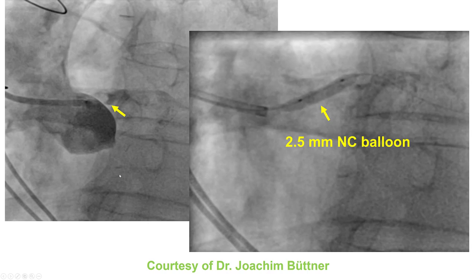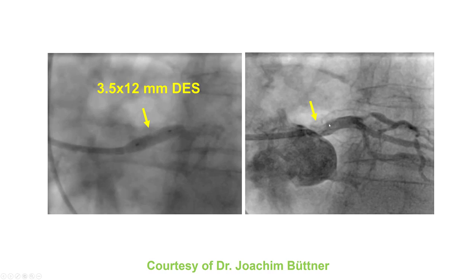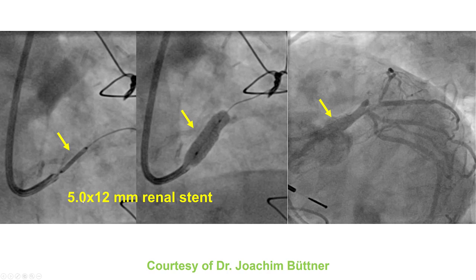This is an example of an osteal heavily calcified left main lesion, showing nice expansion with the balloon. But then the stent is placed and the stent is clearly recoiling, as shown. So a bigger renal stent with very high radial force is placed, and that provided a very nice result with excellent flow into the left main.